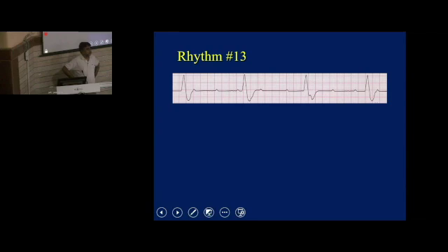If there is an ECG with a heart rate of 30 to 40, why don't we diagnose this ECG as sinus bradycardia? Tell me. Because there is no normal PQRS configuration. We could have called it sinus bradycardia, but sinus means normal sinus rhythm, and there is no normal PQRS configuration in this ECG. So we cannot call it sinus bradycardia. The rate is very less; normal should be about 60, here it is about 30 to 40.